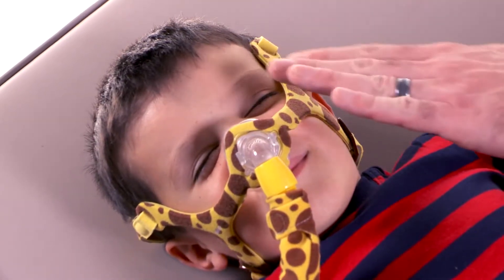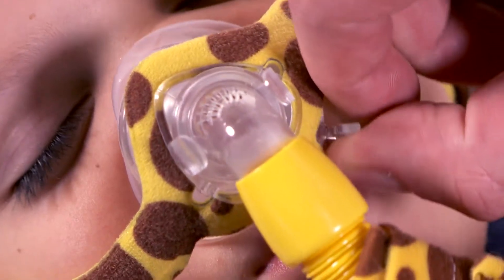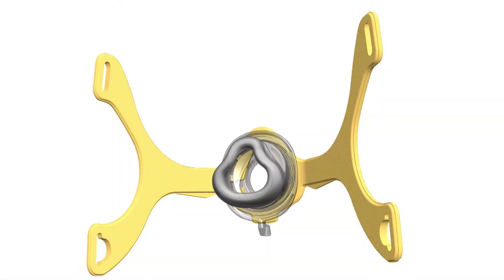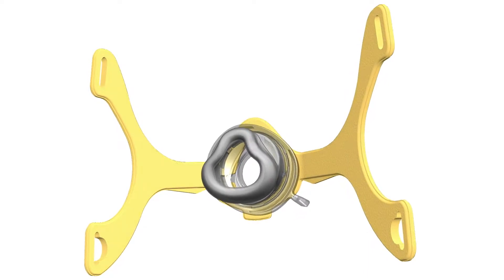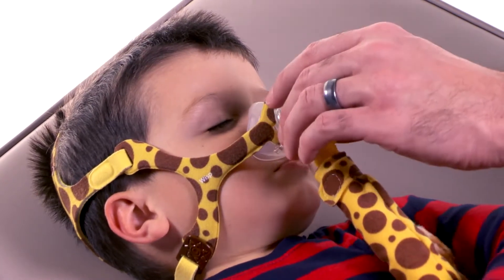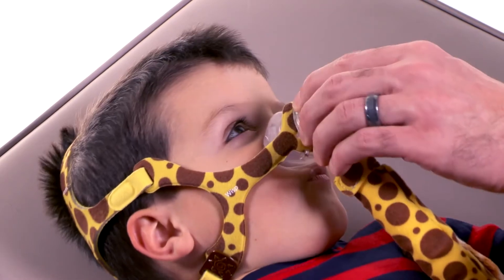If the child experiences small air leaks that appear while sleeping, gently turn the leak correction dial to the left or right. The leak correction dial design widens the front of the frame, gently nudging the cushion closer to the face. If this doesn't correct the leak, reseat the mask by pulling it directly away from the face and gently setting it back into place.